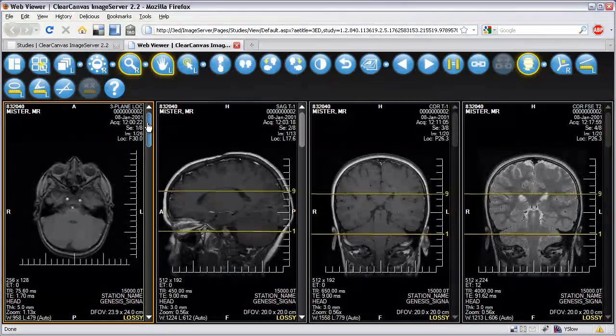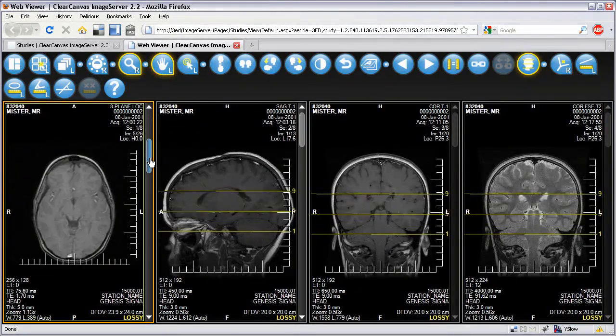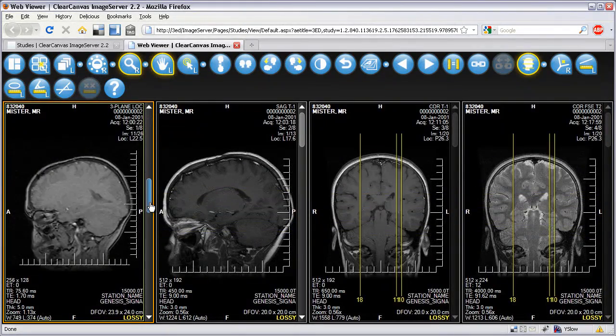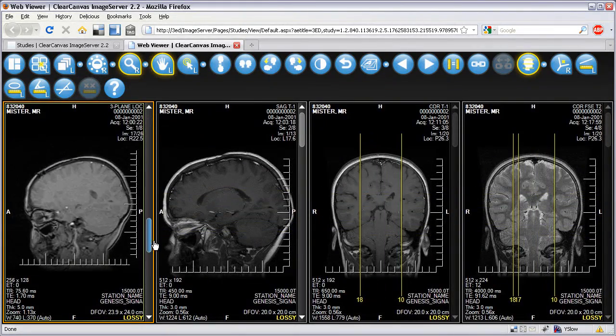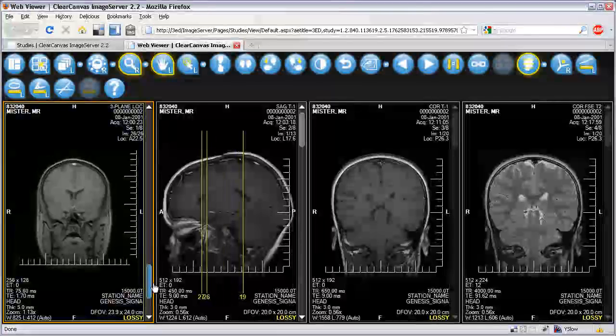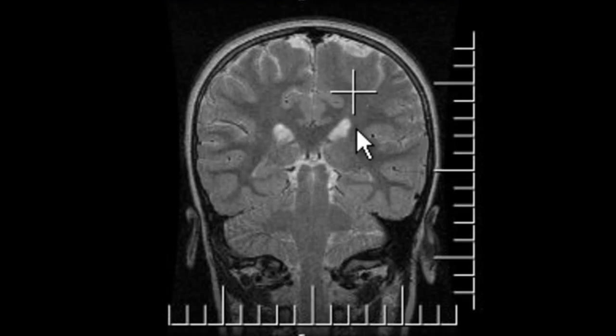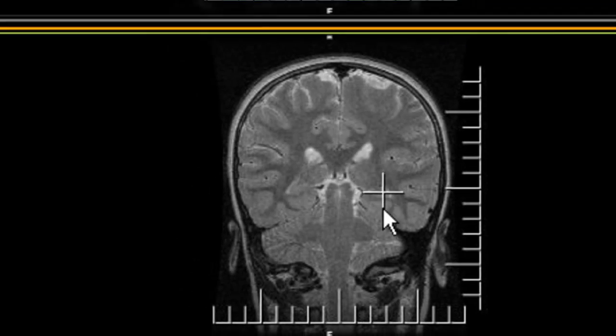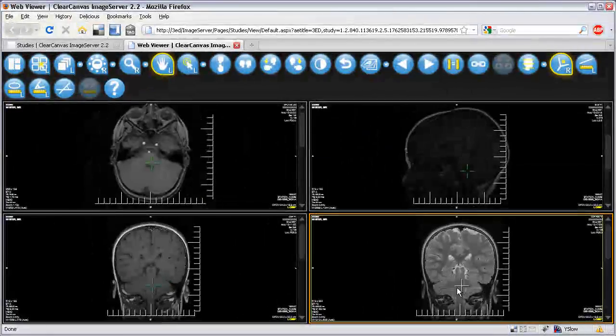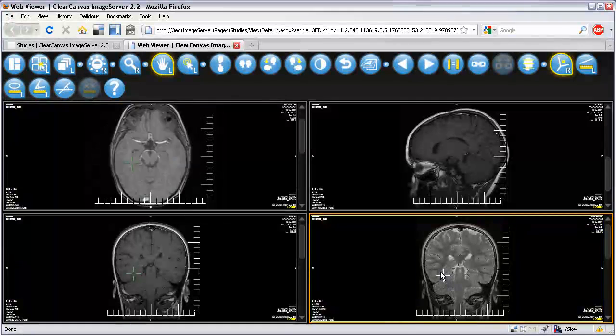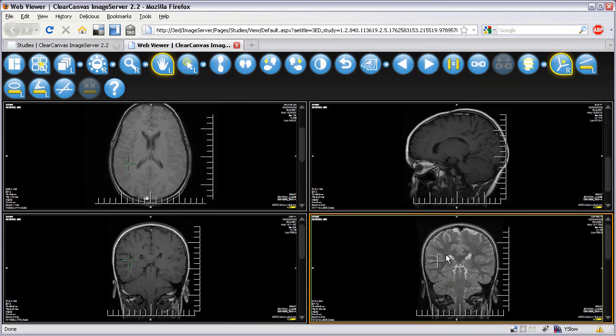Finally, the webstation also includes advanced viewing features like reference lines for viewing the intersection of images in different planes, and a spatial locator for locating a point in space across all image planes.